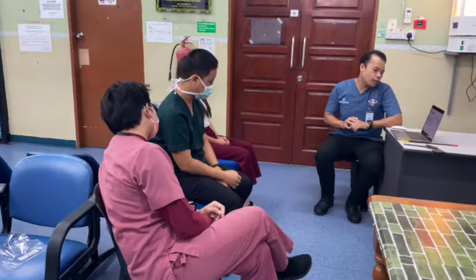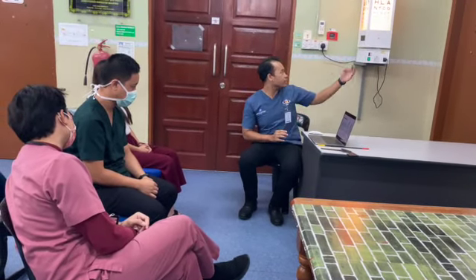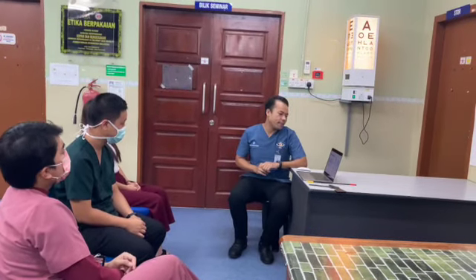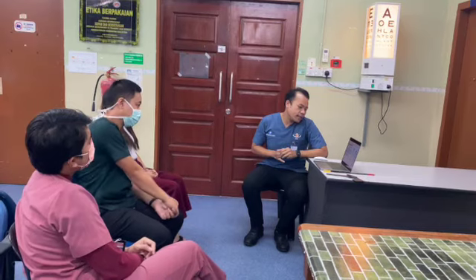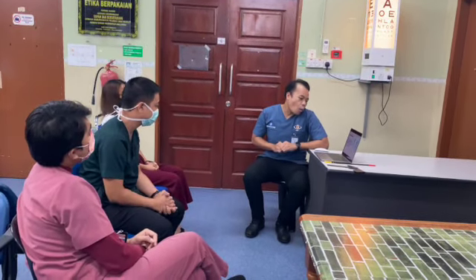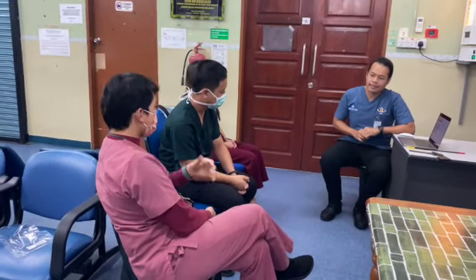The most frequently used eye charts are the Snellen chart and the tumbling E chart. The test tells your eye doctor exactly what prescription you need in your glasses or contact lenses.